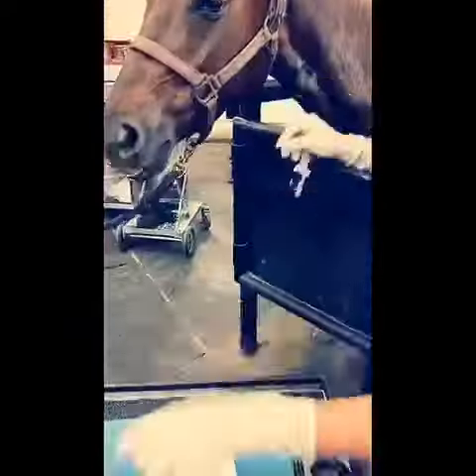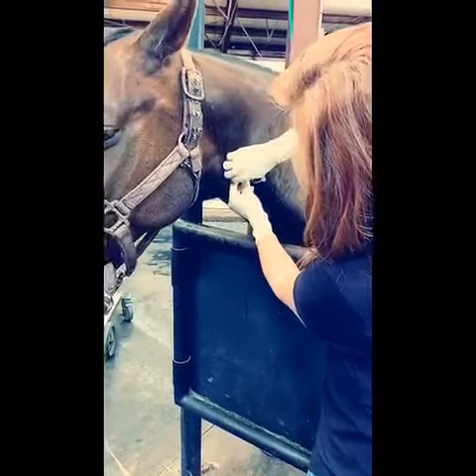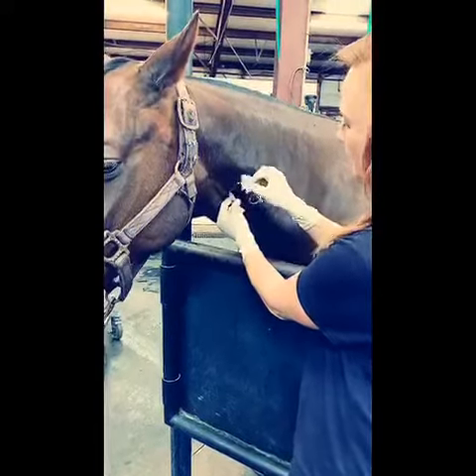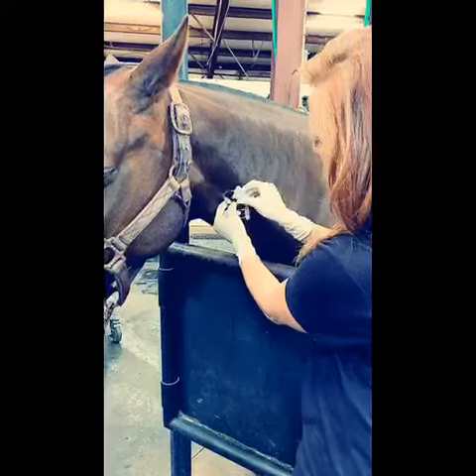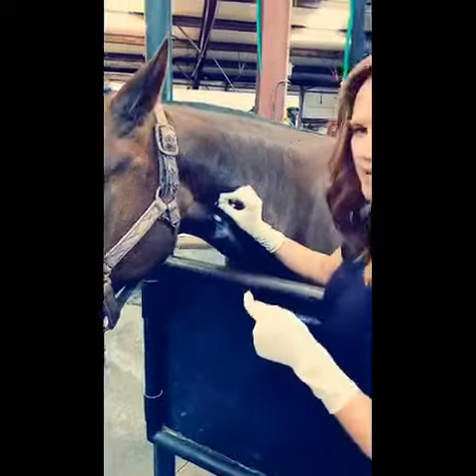Once blood flow is noted, I'll attach the spinner set. The nice thing about this set is that it spins separately from the catheter body, allowing motion in the extension set. Once in place, I'll suture it for extended use in our equine patients.